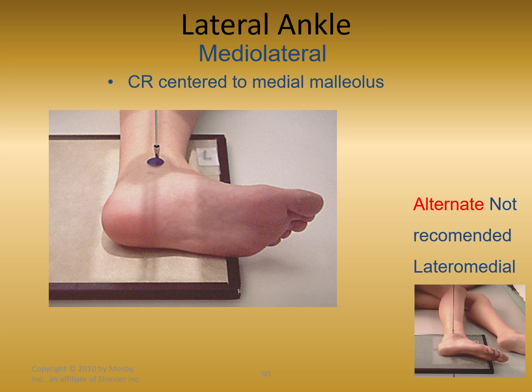For the calcaneus, the center ray placement was inferior to the malleolus. On the lateral ankle position, the center ray is right on the malleolus, the medial malleolus, right? So I want to make sure that you don't confuse the calcaneus position with the lateral ankle position. We're going to see more tib fib in this image for sure, where our collimation won't be as tight. We'll include the tib fib in this image.